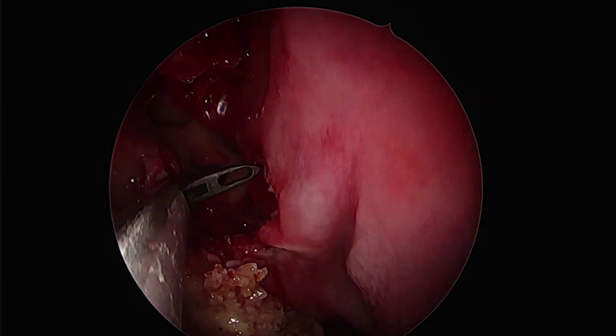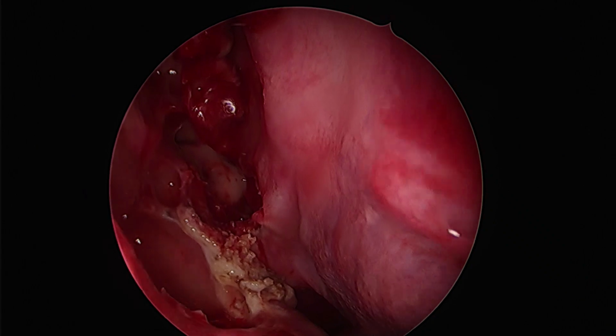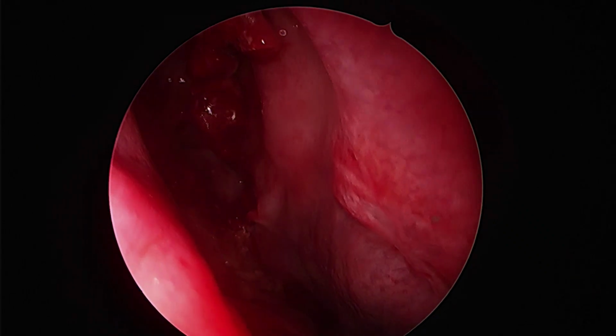So once again we use an angled through cut in an upside down manner.